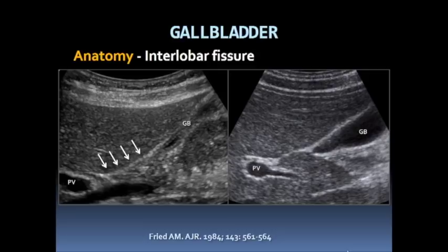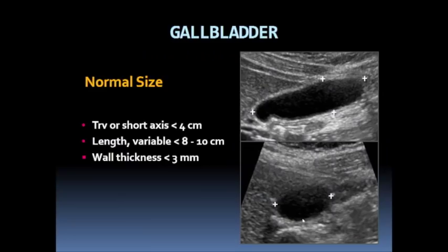On a longitudinal view, the interlobar fissure connects the gallbladder to the right portal vein, delineated by a linear echogenic line. In 70% of scans, you will see the interlobar fissure. The upper limit for the normal gallbladder is 4 centimeters in transverse or short axis, which is the most important measurement when assessing gallbladder size. The gallbladder length can be quite variable, but the upper limit of normal is typically 10 centimeters.